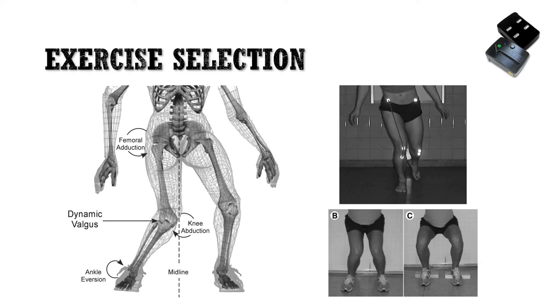If you look at images B and C, you have a nice example there of valgus and varus. Valgus is on the left, image B, and varus is on the right, image C. And in the top right hand corner is just a way of representing it on a more human, global scale. You can see the three retroreflective markers that have been positioned, one on the front of the hip, the ASIS, the patella, and the tibial tuberosity, which I believe you used in your project, possibly.